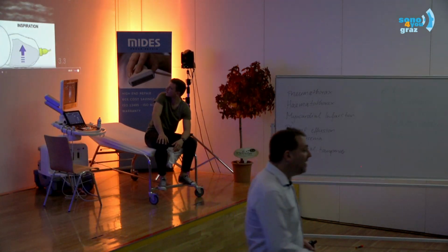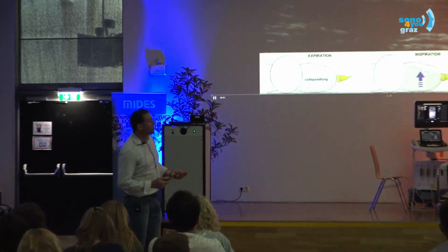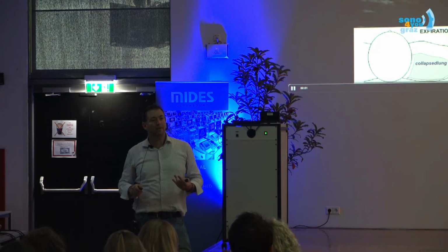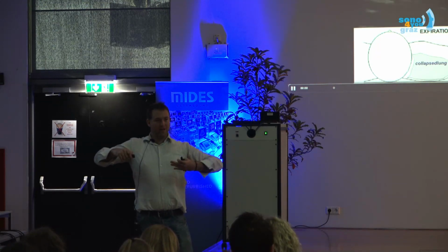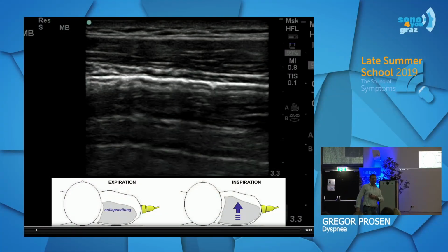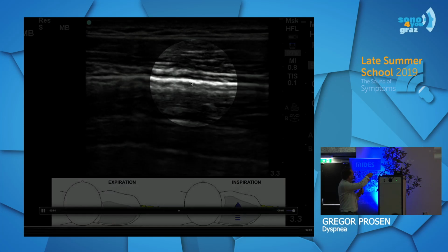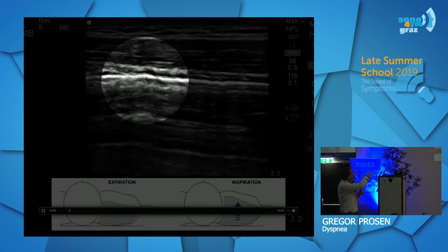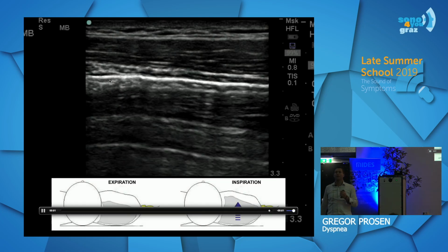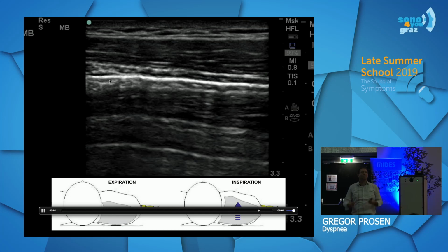And if he has pneumothorax, if he's supine, lying down, and when he breathes in, if the lung is not totally collapsed, what do you think will happen? This lung will expand a bit, right? And if we are with the probe here, with breathing in, a new pattern will appear. What is the pattern here? You see something moving here, up to here, but no movement here. What's that? Lung point. Exactly. Lung point.